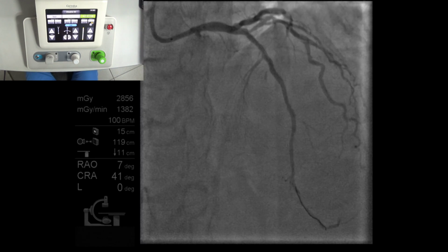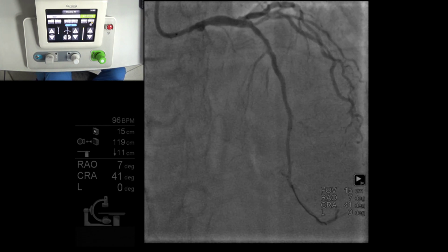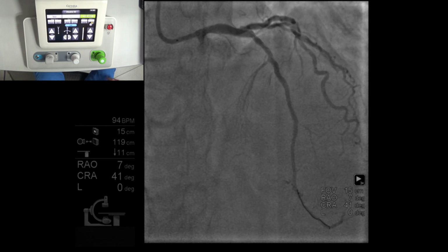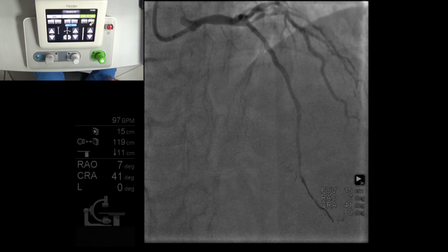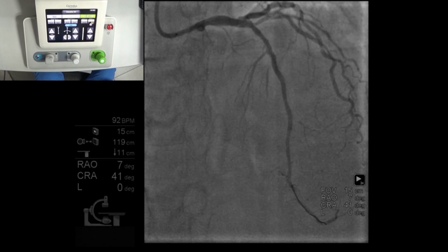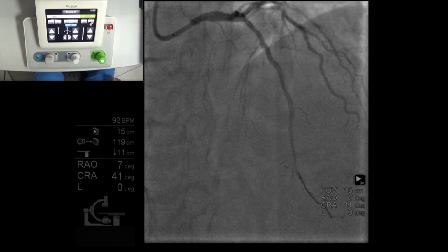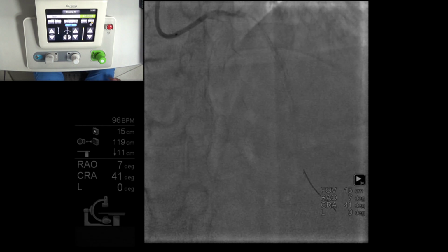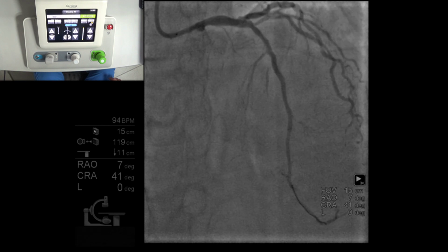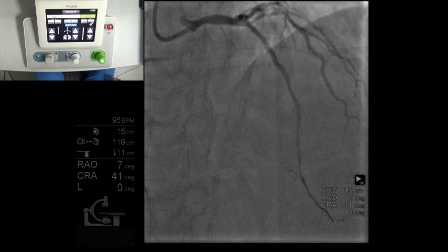Okay, so now the guide is seated again. Beautiful. Okay, let's take a picture. See what I told? I don't know how you know this stuff. Now there is negative residual, both sides. 2.25, okay? So do we post-dilate that middle waist a little bit, or are we good? You tell me. I think even if you were at your place and I am working on this patient, at that point I will leave it, or else if at all I want to post dilate, I will decide 20 atmosphere. If it doesn't open, I leave it.